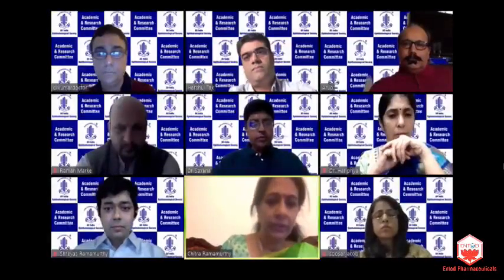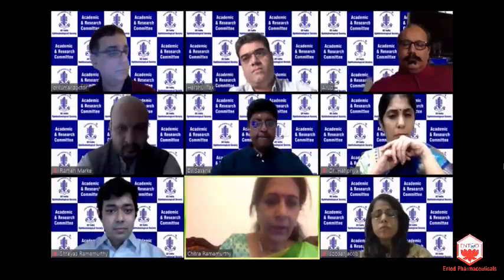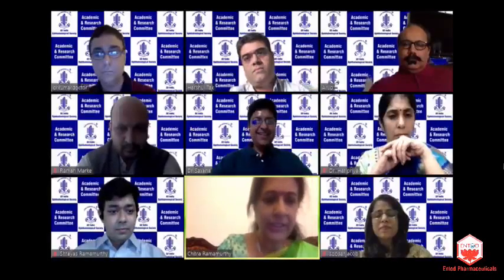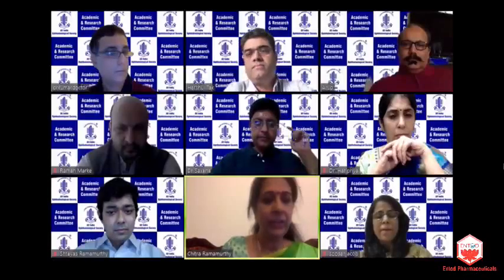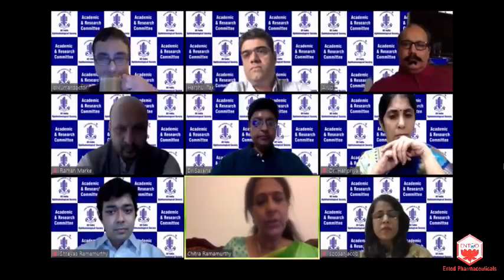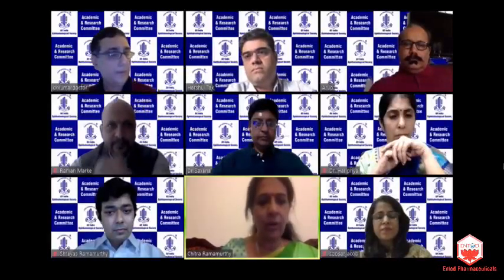Dr. Susan, I find Dr. Kumar is literally swearing by the flap motility sign every now and then. Do you think that you could have an inverted fluttering flap and you would be so confident and continue a Phaco being sure that it would not extend at all?